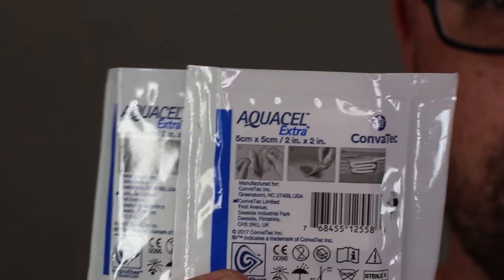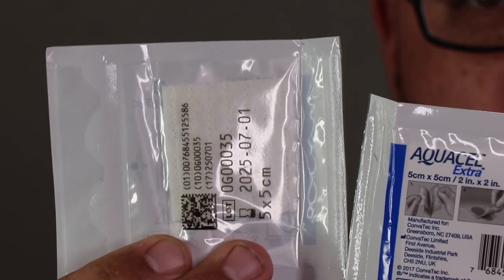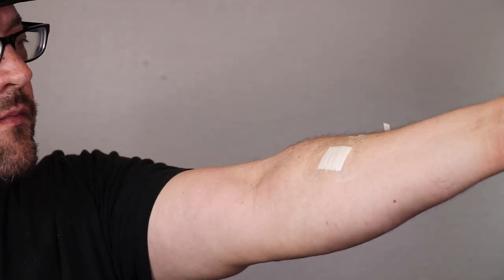Next, I have two AquaCell Extra wound dressings. These are composed of two layers of hydrofiber technology that are stitched together. This type of hydrofiber dressing is specifically suited to help manage moderately to highly exuding wounds. When it gets wet from blood, it turns into a gel-like substance, which helps when you eventually remove the bandage as you don't want to peel off a scab.